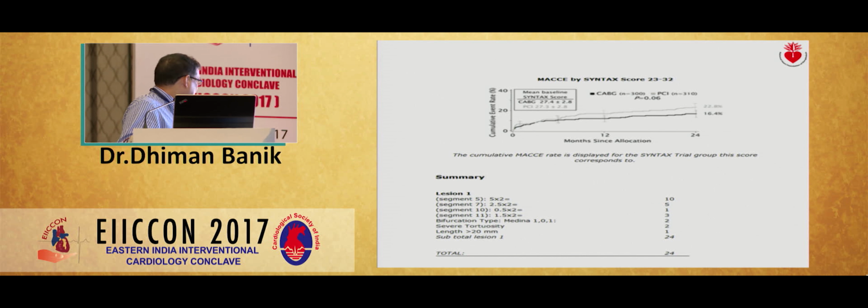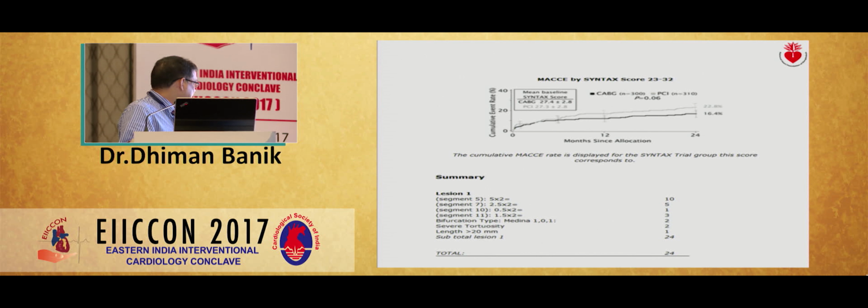So this will be treated as a bifurcation lesion, and there is significant disease in the left circumflex ostium. But the left main lesion is not that severe, because we know that in normal anatomy there is 20% narrowing of the distal left main. That's normal anatomy. But we have to do some IVUS or FFR to clarify things further. I think we completely agree on that. We must see the distal left main along with the other branches with the help of IVUS.